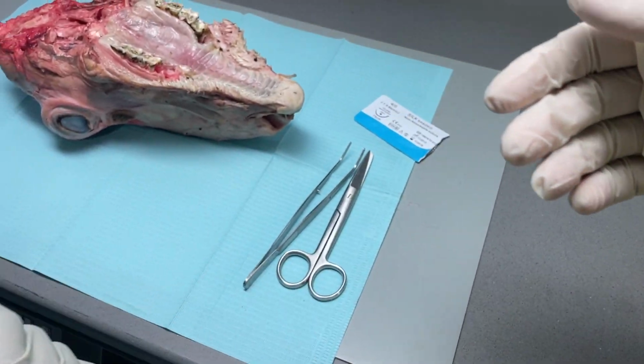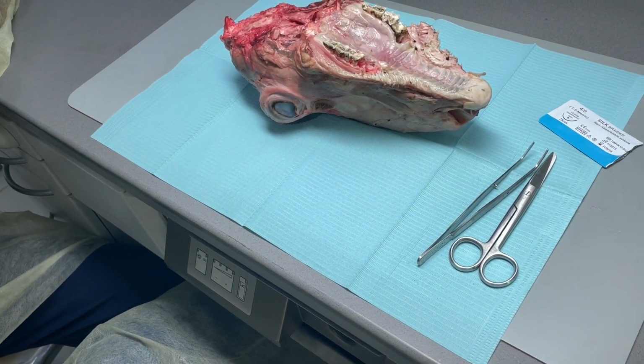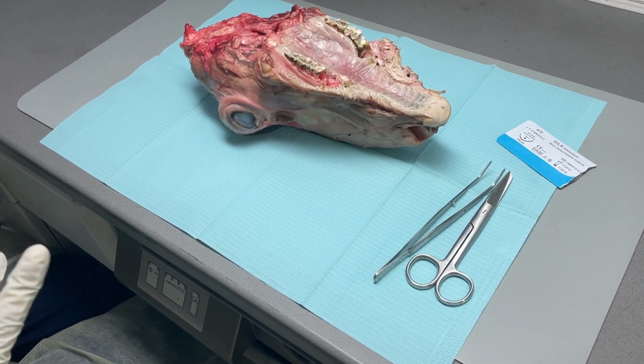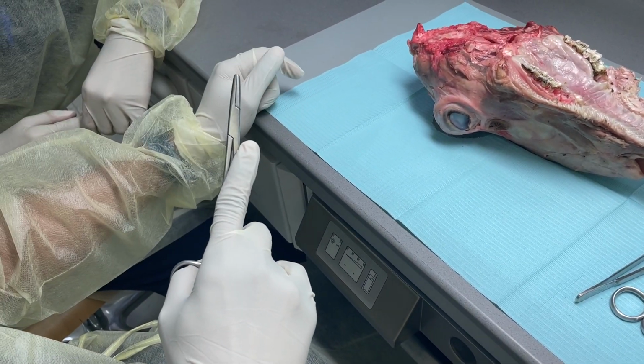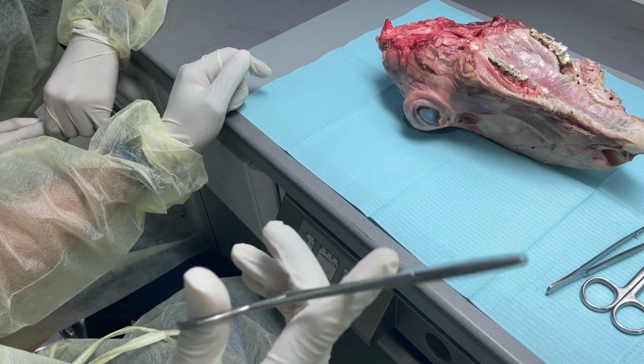See, you can use which finger you are comfortable with. This index finger or this, and the thumb. No problem. I usually use my middle finger, so this finger I can use if I want to support like this. Or I can use this finger here. Whichever you are comfortable with, you can use.